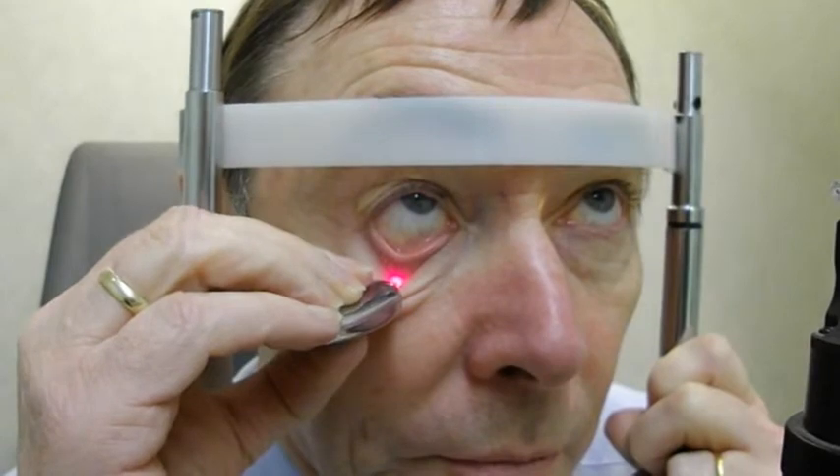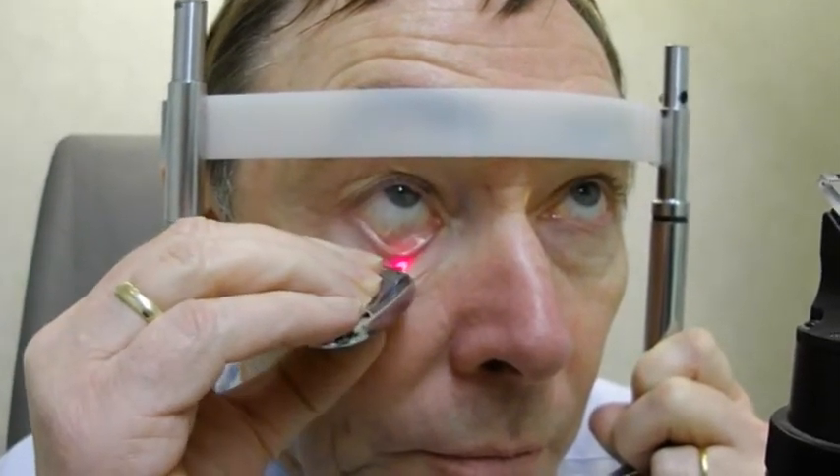You can see the meibomian glands through the eyelid. You can increase magnification if you wish. This meiboscope is made using a little keyring torch.